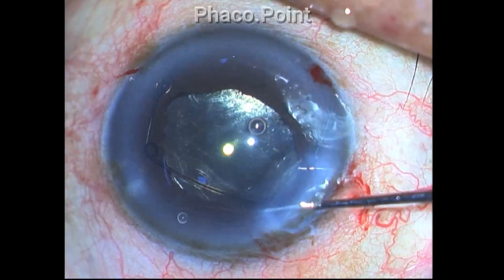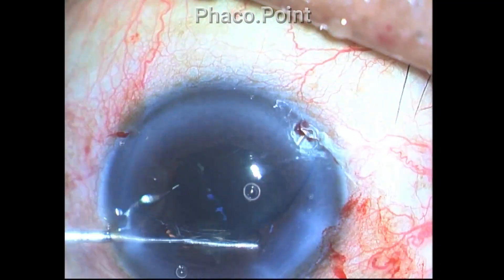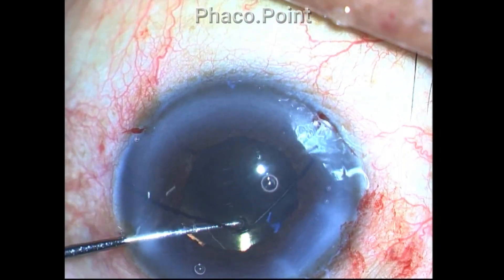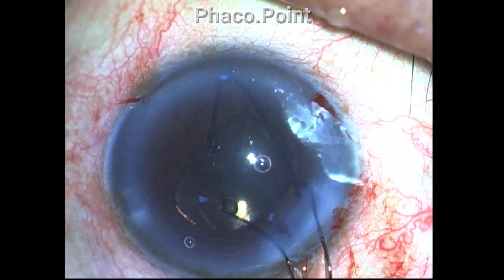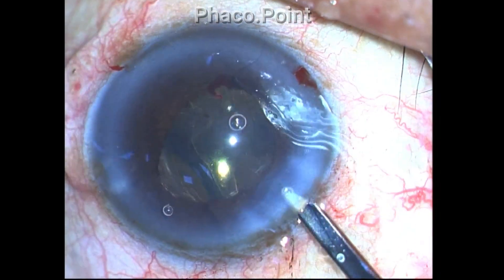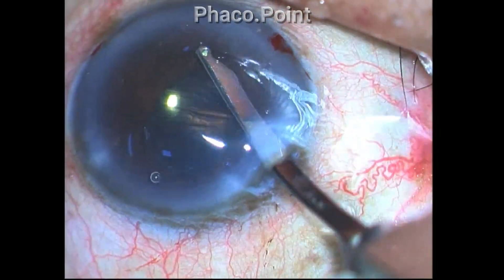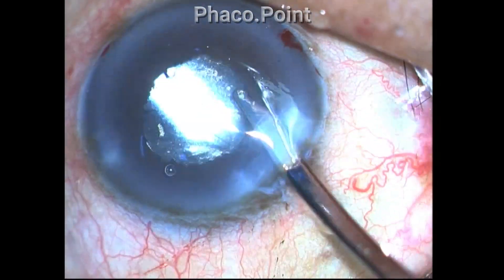Of course it makes us wonder whether there is vitreous in the anterior chamber or not. My plan was to remove the pupil dilating device first before checking for vitreous coming out from around the pupillary edges, which I would ascertain using intracameral diluted triamcinolone acetonide. The OVD is removed using a Simcoe cannula, because a coaxial I/A cannula has a large flow volume and I did not want to displace the IOL.